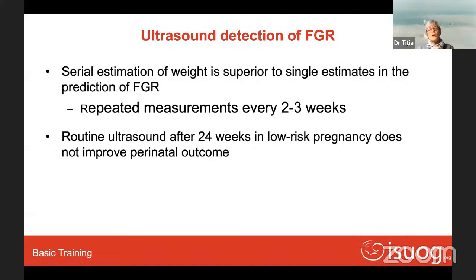So it is important, if you think you're looking at a fetal growth restriction, not to measure only once, but to repeat your measurements to see how the growth is developing. And then you may want to repeat it quickly because you think you know what's going on. No, you shouldn't do that. If you do your measurement within 10 days, then you're measuring your own error. So the rule is you have at least 2 to 3 weeks between measurements. Otherwise, you're measuring your own error. So make sure that you have multiple measurements, but at least 2-3 weeks between them.